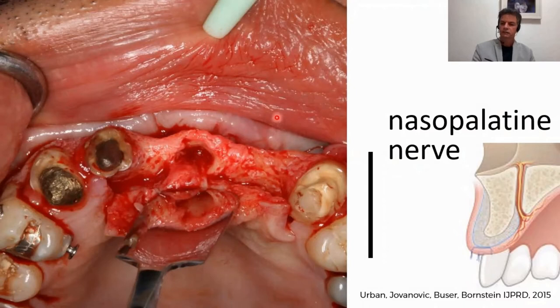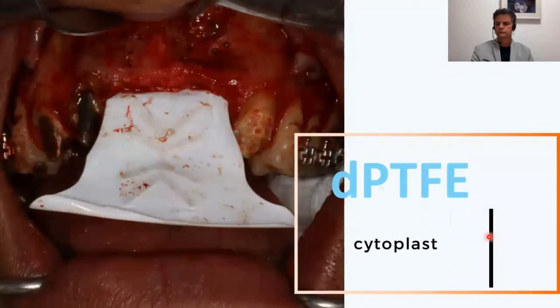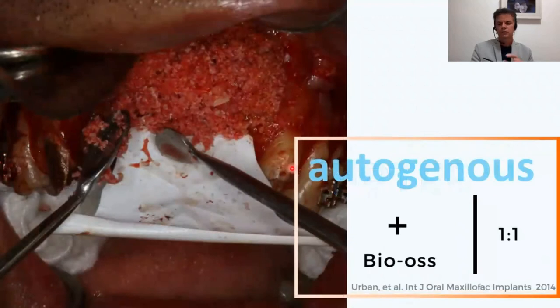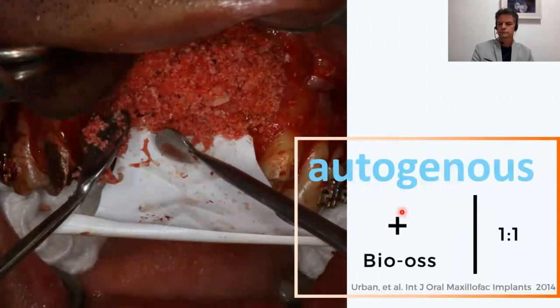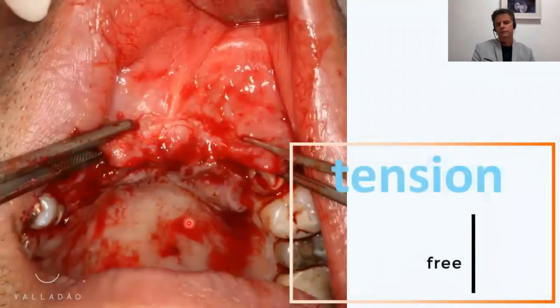After the deflection of the neurovascular bundle, the composite bone graft was placed into the region of the incisor foramen, partially into the canal, and then horizontally and vertically around the defect. The membrane used was a dense PTFE titanium-reinforced membrane, the Cytoplast. The bone graft was a mixture of autogenous bone and Bio-Oss in equal proportions, as already widely described in the literature.